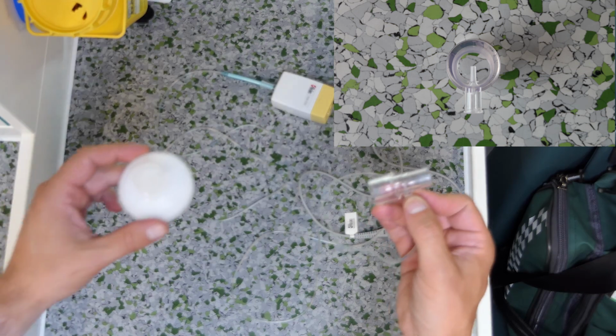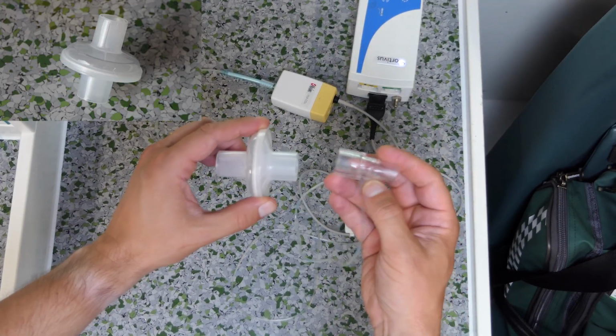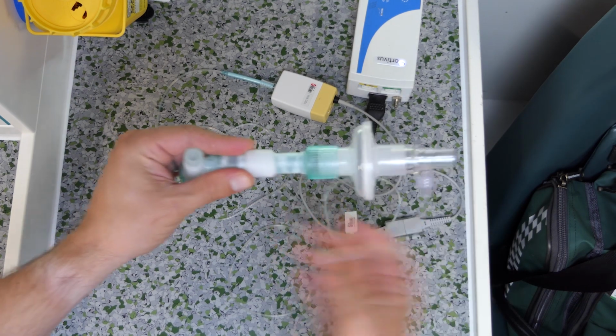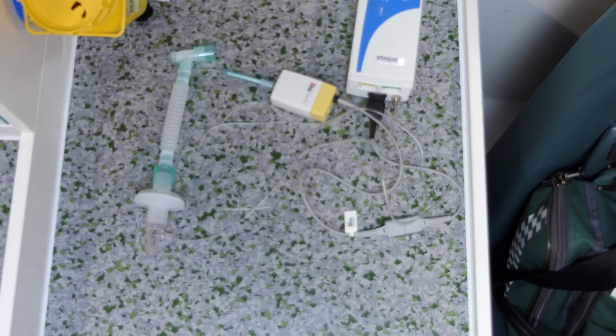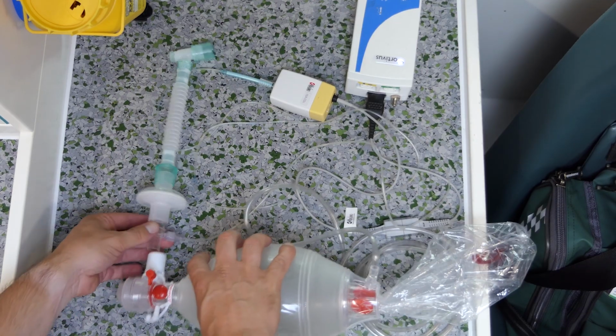Due to the risk of the sampling port getting blocked by secretions, it is advisable to insert a filter into your airway circuit between the patient's lungs and the T adapter. Connect the filter to the catheter mount and the BVM to the T adapter. You are now ready to connect the equipment to your patient's iGel or ET tube.